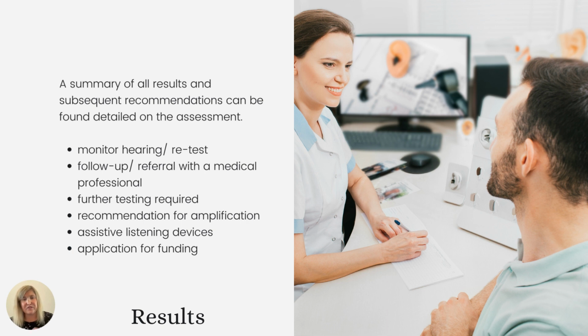Many people or students who have a hearing test want a take-home message, like how much percentage of hearing loss do I have? Hearing healthcare professionals hesitate to provide people with a percentage of hearing loss because at certain frequencies, the individual may have normal hearing, and at other frequencies, the individual may have a significant hearing loss. As a result, hearing healthcare professionals choose to describe the hearing loss in terms of a degree.